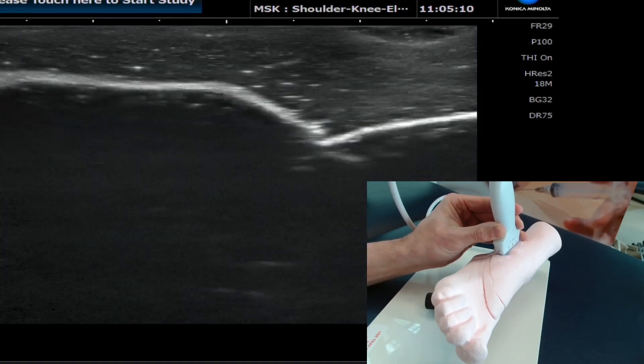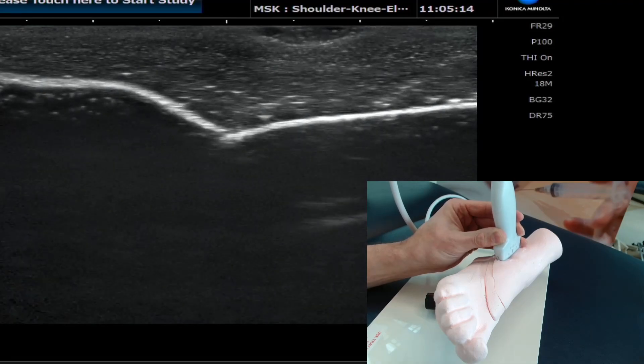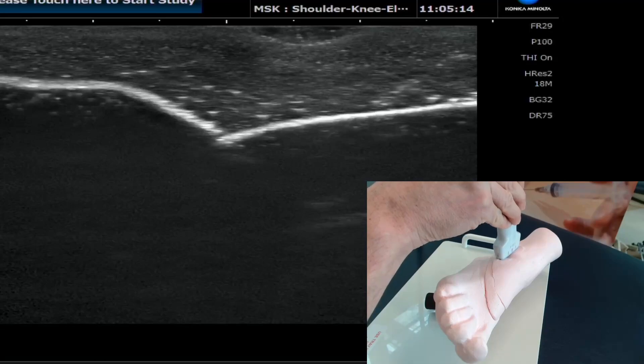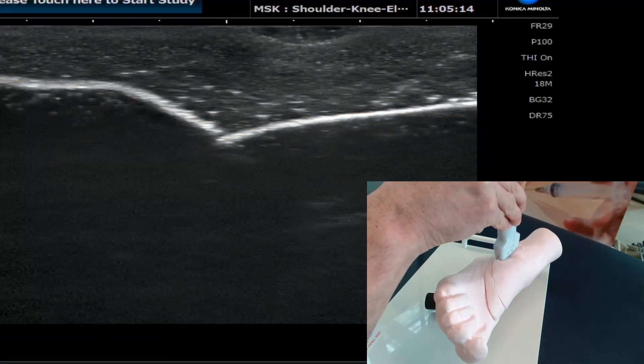From a skeletal anatomy and landmarks point of view, what we're looking at here is the talus, which is here, and the distal fibula, which is here. This region here would be the ankle joint, and that's what we're going to be targeting with this injection.